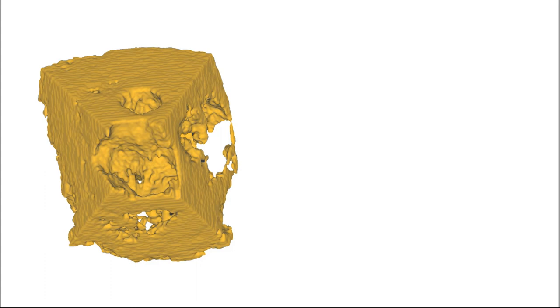You're welcome to keep going with the hearts, but for those of you who are bored with that part, we have a few 3D data sets, so I'll put them up one at a time. Try to orient your heart base to match what you're seeing on the screen. For example, this is a mitral valve, and there appears to be a valve in front of it, that's presumably the aortic valve. So the heart base would be something like this. Once you picture that, you can quickly figure out what these dimples are and what's going on there.